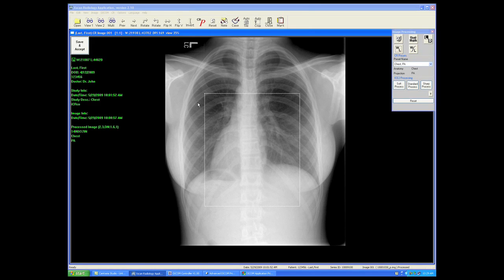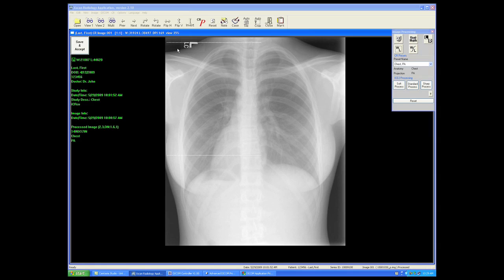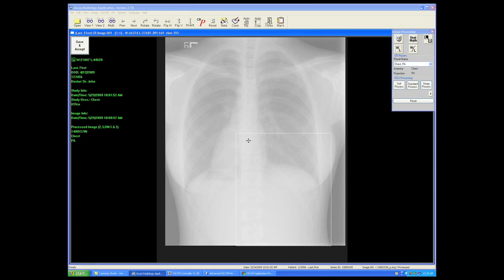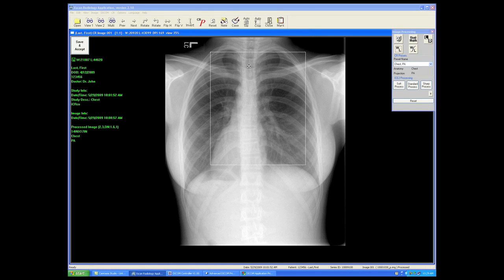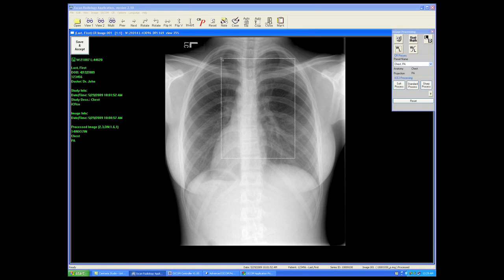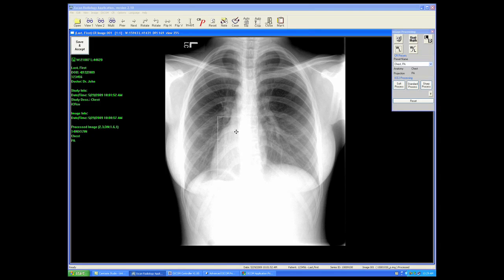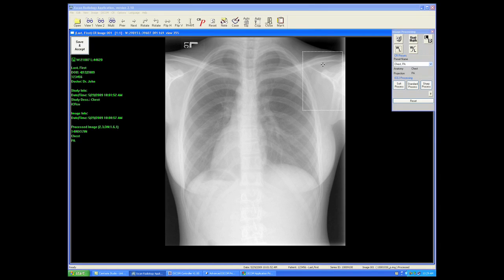First, I will change the placement by bringing my cursor into the smart box until it turns into a black crisscross, then I'll use the left mouse button to drag and drop the smart box to a different location, thereby changing the window and level because I am changing the grays, the blacks, and the shades contained within the smart box. I can also change its size — its height, its width, and its overall size. By dragging it to a new place, I will be changing the window and level each time I drop the smart box.